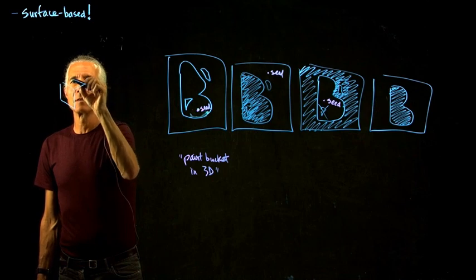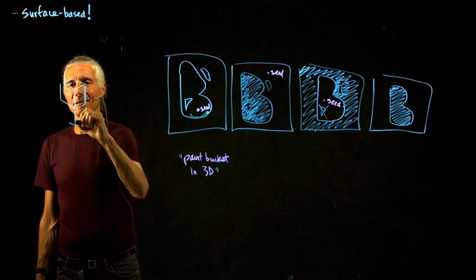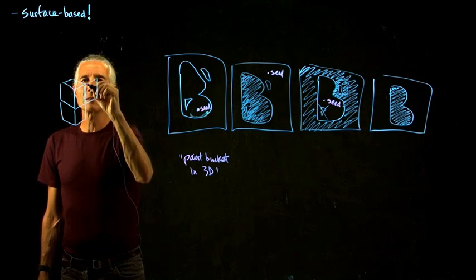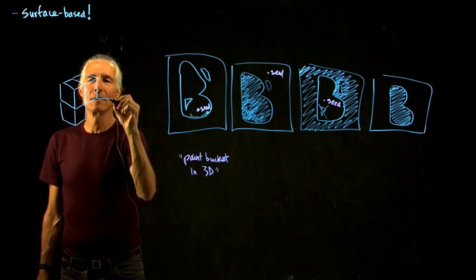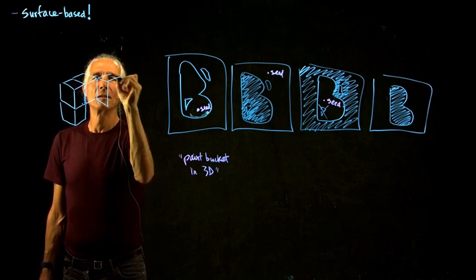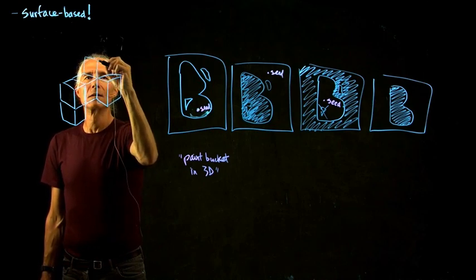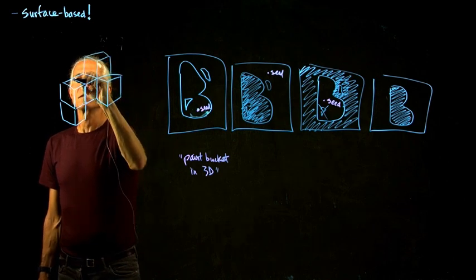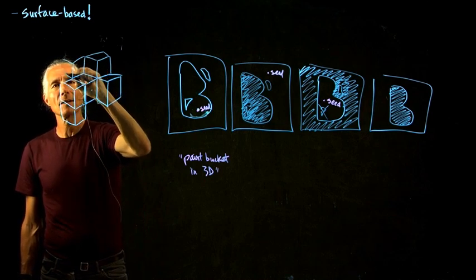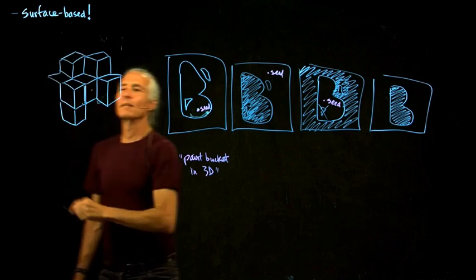So there's one voxel. This is going to take a while, isn't it? Okay, here's another voxel. These were voxels that were classified as white matter. All these white matter voxels there. So it goes off that way. You can see you can get complicated situations here.